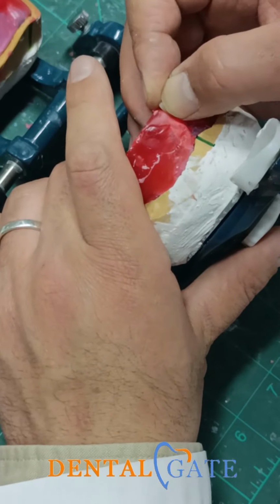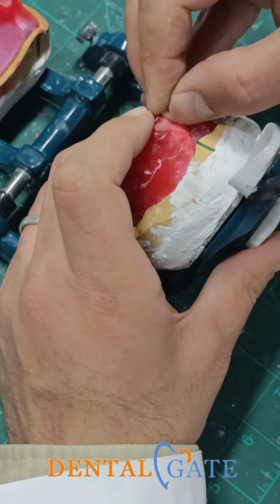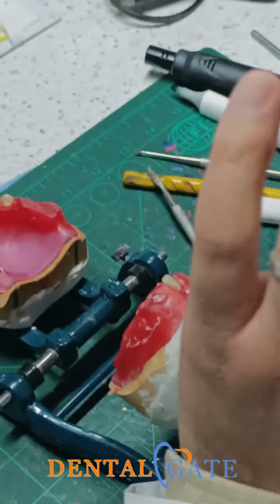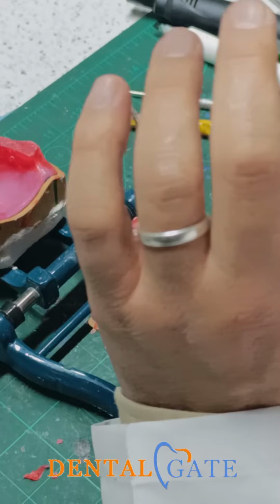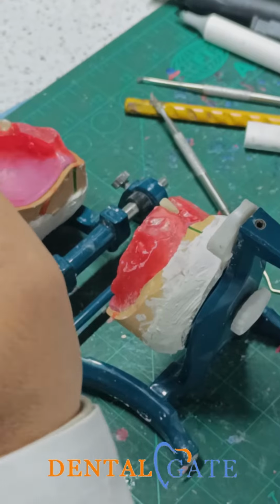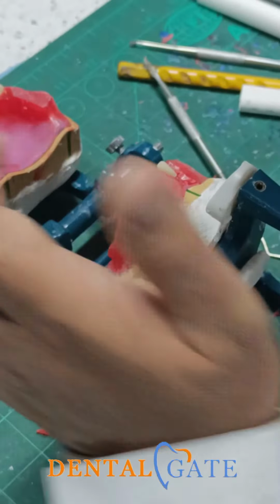Don't make any inclination in the bite rim. After that, on the labial aspect, when I check from the distal, from the proximal, it should not have the proclination as in the upper central. Okay, not severe proclination, because I will check this proclination according to my overjet.